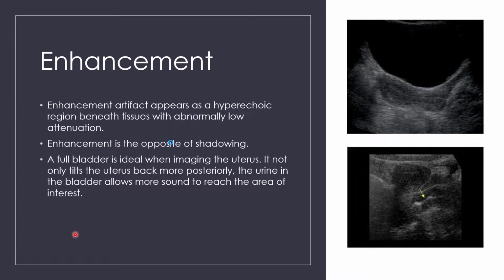So I'm going to take a brief moment here because I haven't explained some of these sonographic terms. If you have a pen or pencil and paper and you want to write this down, there's a couple of terms that you need to know. Hyperechoic means that there's an increase in the echoes. So if something is referred to as hyperechoic, then it means it's going to be brighter on our screen than the structures around it. Okay? Hypoechoic means that there are fewer echoes. So it's going to be a little darker on the screen than the structures around it. Okay?